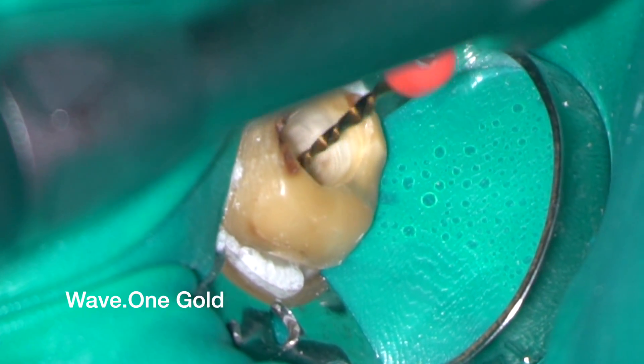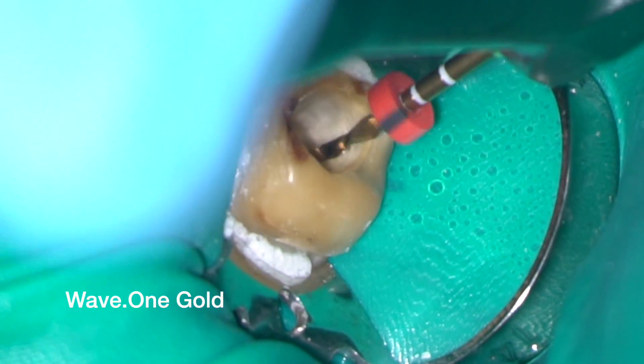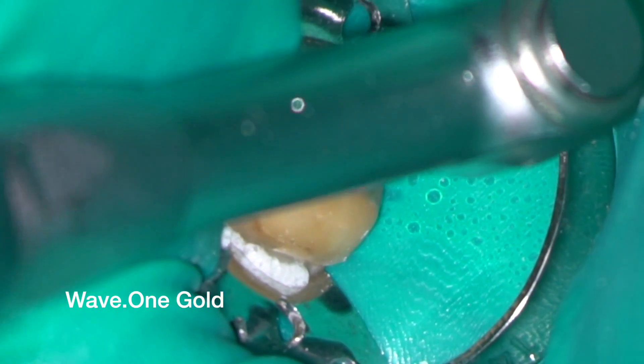After confirming the working lengths again with an electronic apex locator, the canals were rapidly tapered using Wave 1 Gold instruments.